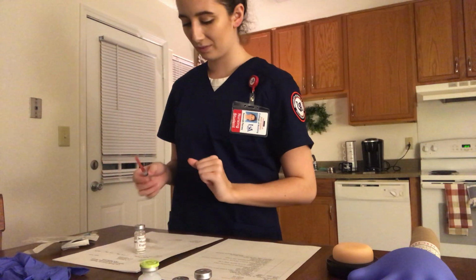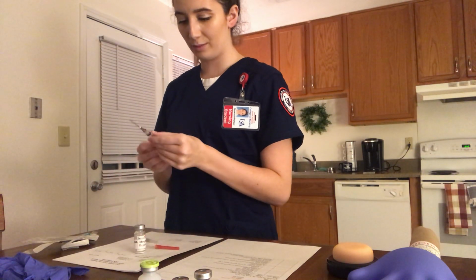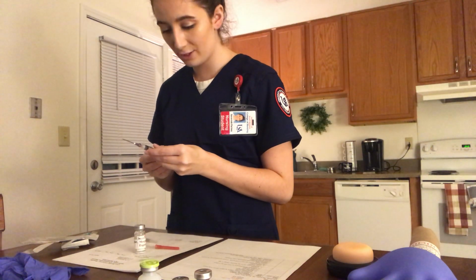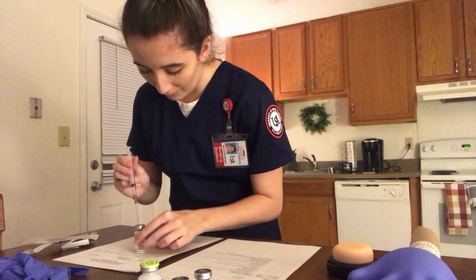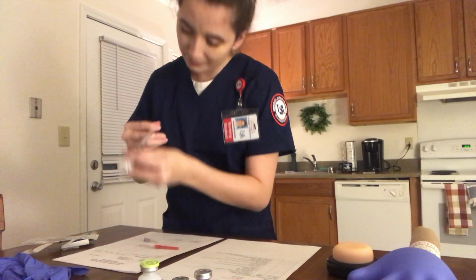Alright, take the cap off. And I will take out the equal amount of air that I would for the dosage, so half a milliliter of air. I will insert it and push the air in.